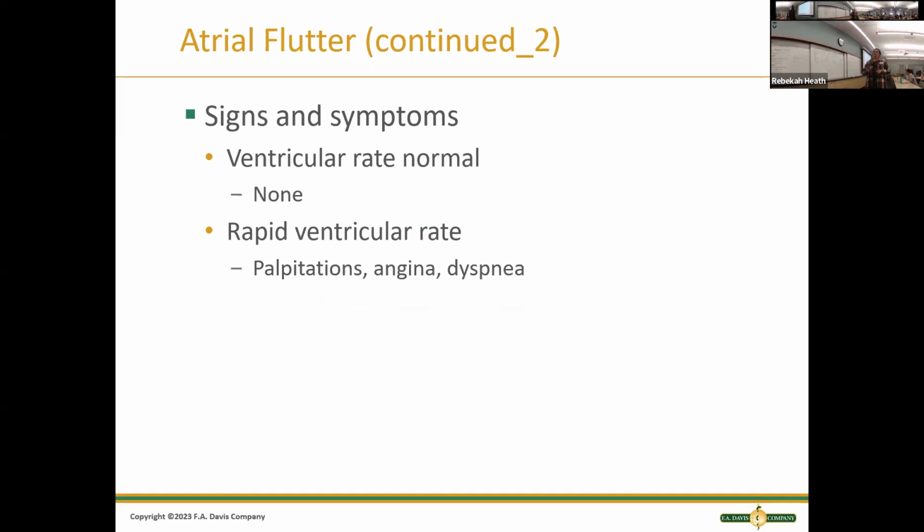They might have palpitations if their rate goes up. Now, what is our rate for our atrial flutter? If we count the QRS, are there 9 QRS complexes in what I'm looking at? So this is still within a normal heart rate.